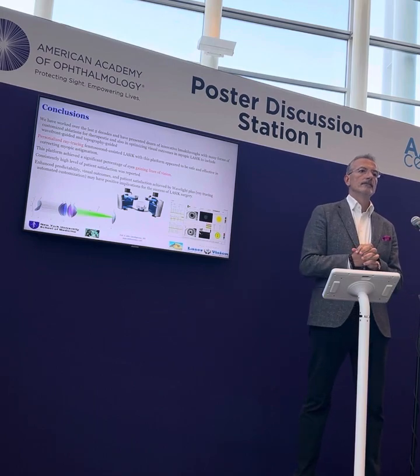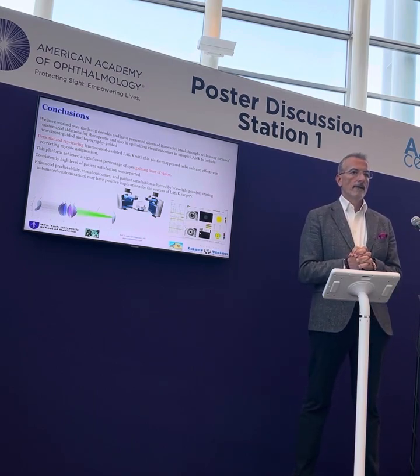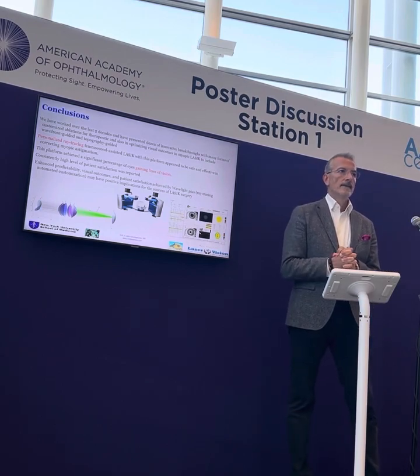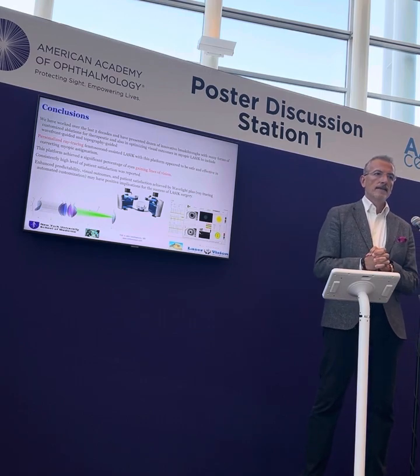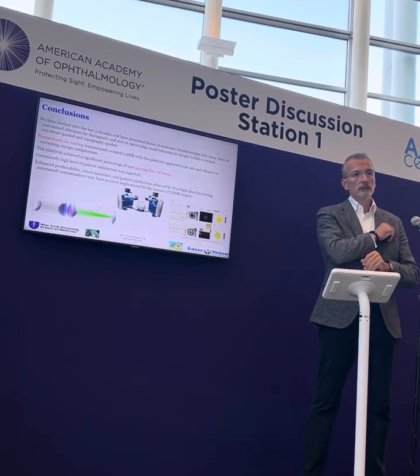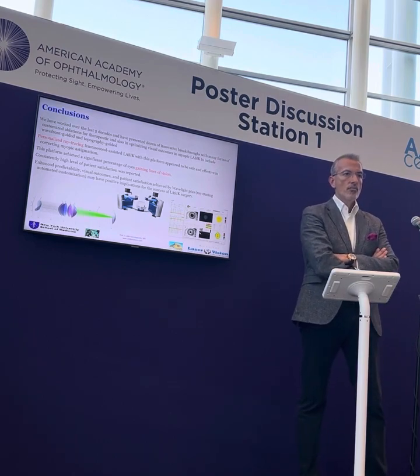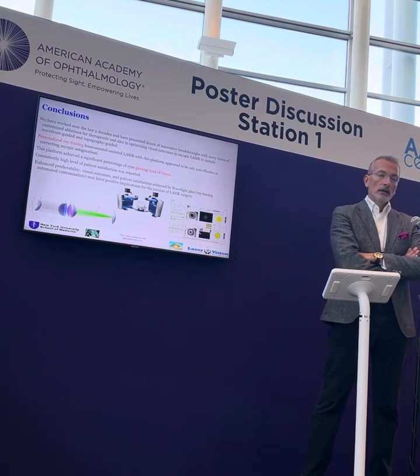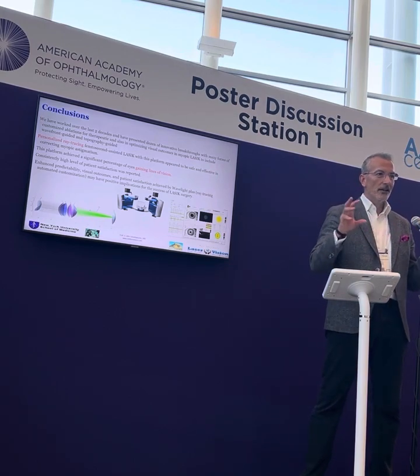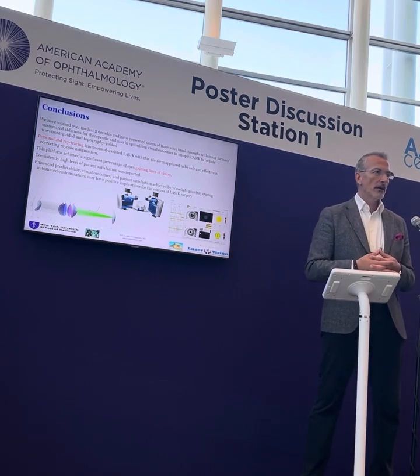The concept of not needing to adjust because you could just plug it in and it iterates makes it very patient-specific, but there's always a surgeon factor to a nomogram that every surgeon's going to do something a little different. Have you any sense about that among the surgeons in the study? You bring up a very good point that should include this group in a whole day session brainstorming. And I thank you for making this, Ron.